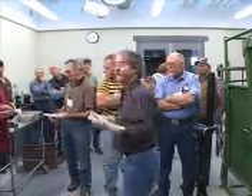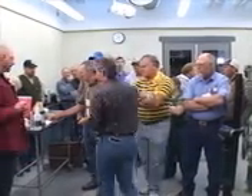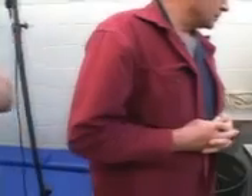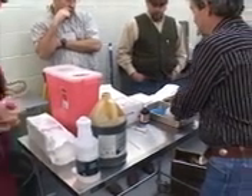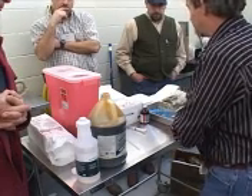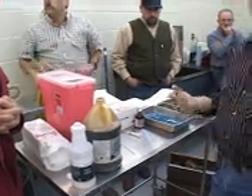As soon as I have finished with that biopsy, I will come back over to my tray. I'll rinse my forceps, I'll put my biopsy needle into the tray and rinse it back and forth, both closed and opened. At that time I'll take my scalpel and put it into the alcohol, because then I'm ready to drop this animal out of the chute and load the next animal.